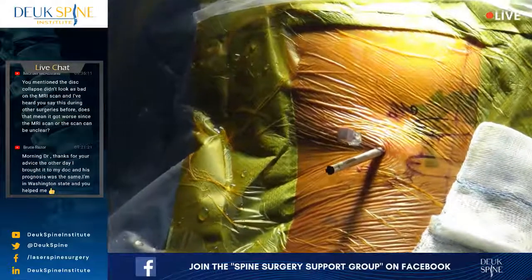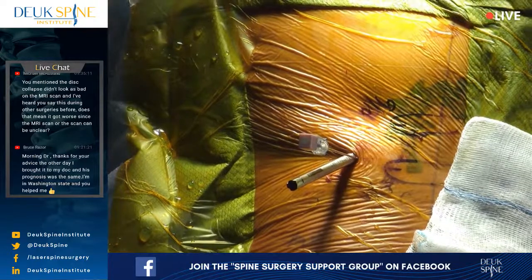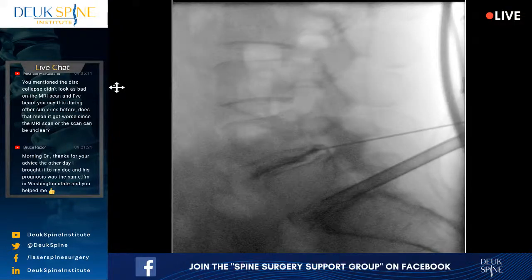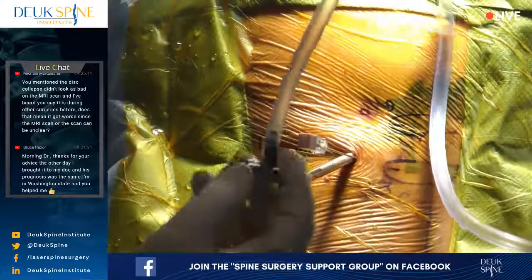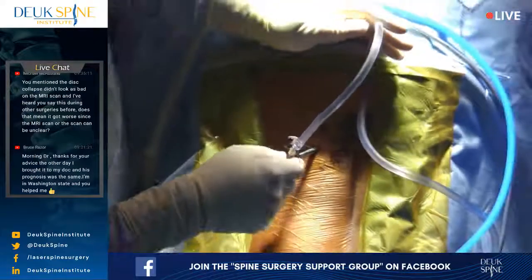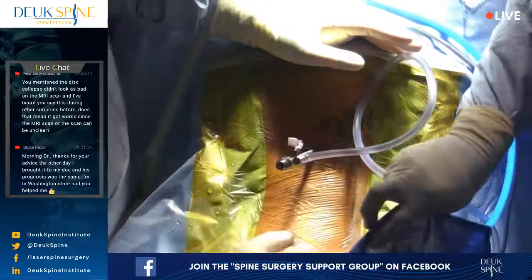And you don't want to be in too far. You want to be in, usually no more than halfway in. Usually a third to a half is good. Depends on several things. But the angle of the fluoro will tell you one thing versus another. Parallax, complicated imaging variations. So you have to take all that into account.